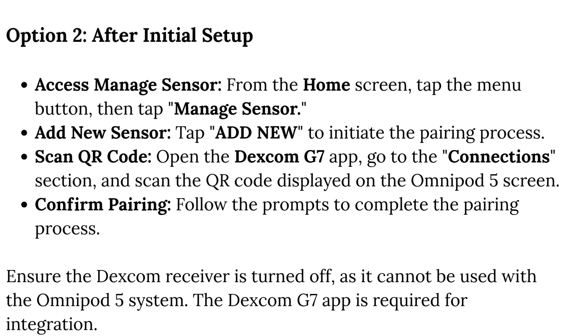From the Home screen, tap the Menu button, then tap Manage Sensor. Tap Add New to initiate the pairing process. Scan QR code: open the Dexcom G7 app, go to the Connections section, and scan the QR code displayed on the Omnipod 5 screen.